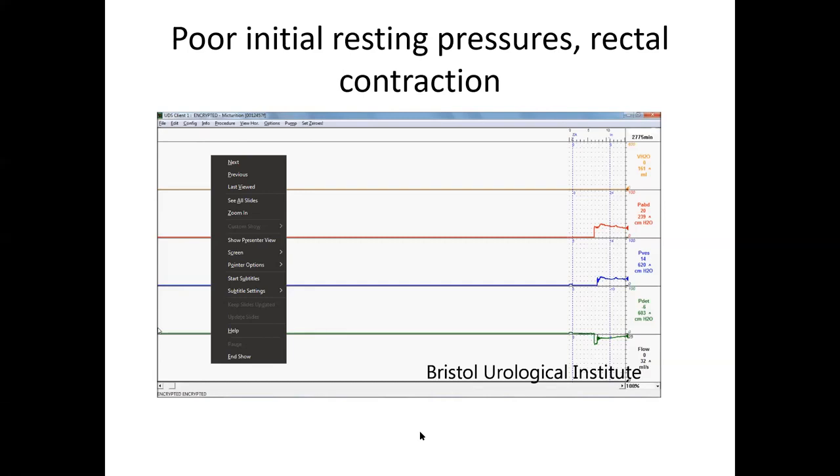Who hasn't answered? Flush it. Fantastic. Okay, so this chat box does work. You would flush it. So you'd flush to either remove an air bubble, to buy you a bit of time, to work out why that line isn't working properly. Once you've flushed it, what would we then do to check that it's actually working?